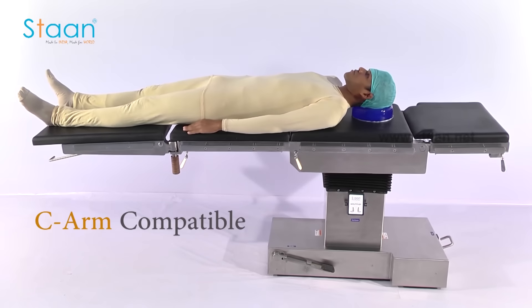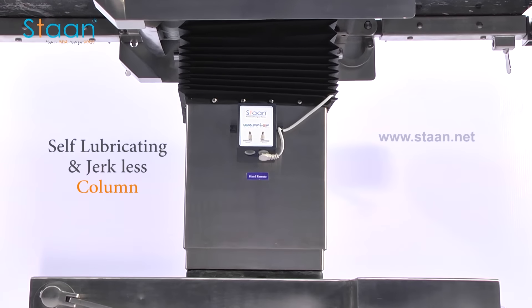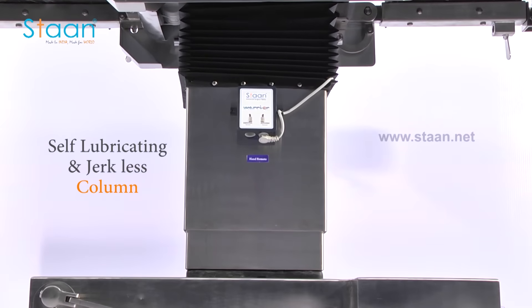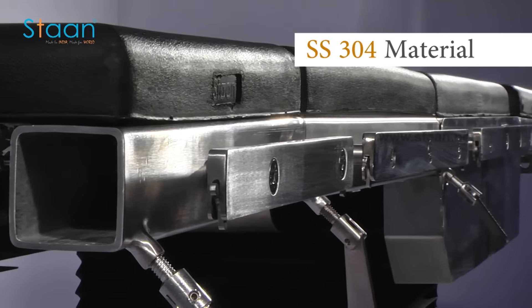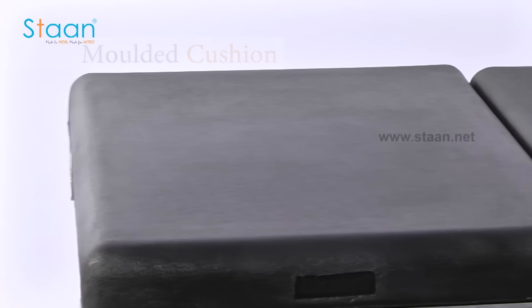It is C-arm compatible. It is equipped with a very high precision, self-lubricating, weldless, and jointless steel column, which assures trouble-free, jerkless, and high load-carrying capacity. The entire table is constructed out of SS304 grade stainless steel.